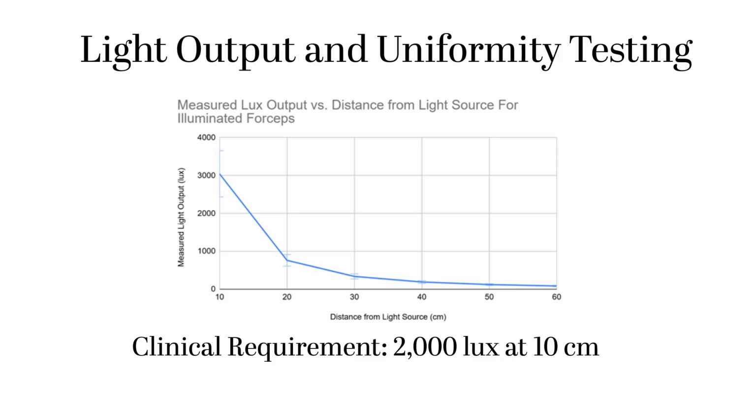As for testing, we mainly wanted to verify that our forceps met two different clinical requirements. The first clinical requirement was an LED light output higher than 2000 lux at a 10 cm distance when being used in small cavities. We were not able to obtain a clear video recording of this, however, since the light output needed to be measured in a dark environment. Using a light meter app, we placed the lighted forceps at varying distances from the sensor and recorded the lux. As the graph shows, our LED lights passed this test and even maintained a lux greater than 2000 until 15 centimeters.